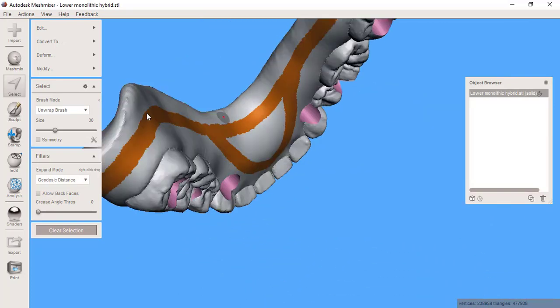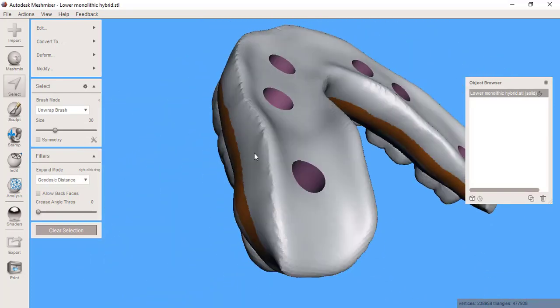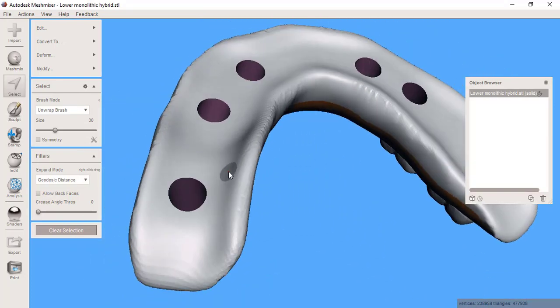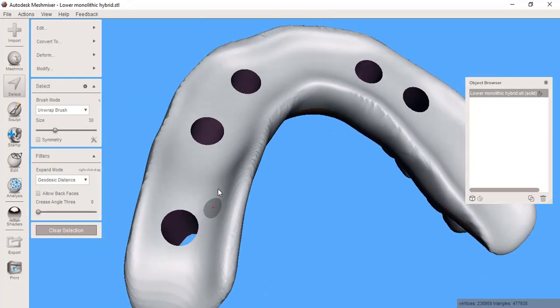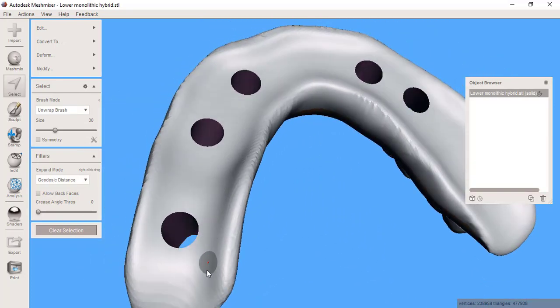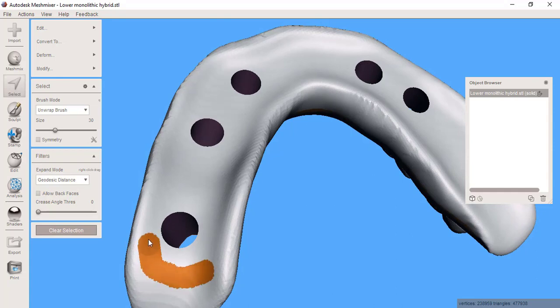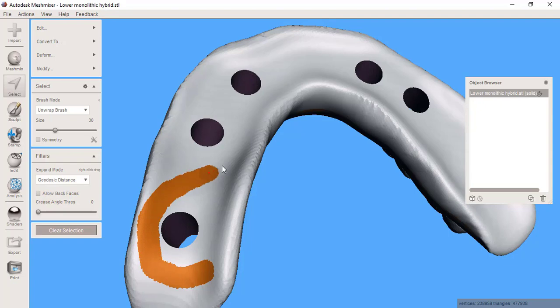Let's go to the underside and do a similar type of thing. I'm just going to crisscross around all of my pickup holes, kind of a figure eight design.